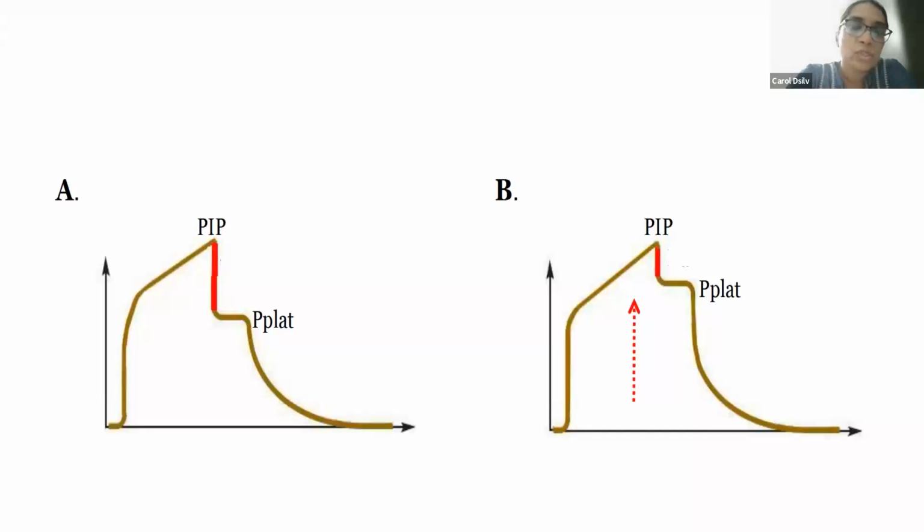Bronchospasm. It's mainly machine related, operator related, and patient related, ma'am. Beautiful. So go as systematic as you can so that the examiners will understand that when you approach the patient, you'll go either from machine end to patient end or patient end to machine end. So tell me some causes, please. Patient related, machine related. Go on, give me some causes. It might be operator related, ma'am. If there is any kinking, so ET tube kink or any clogging, it may be mucus plug.